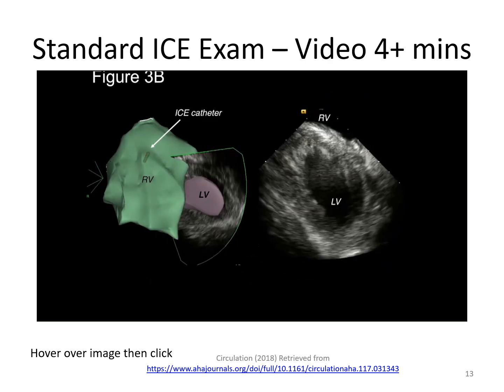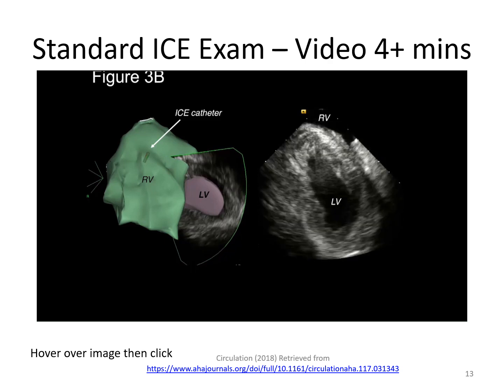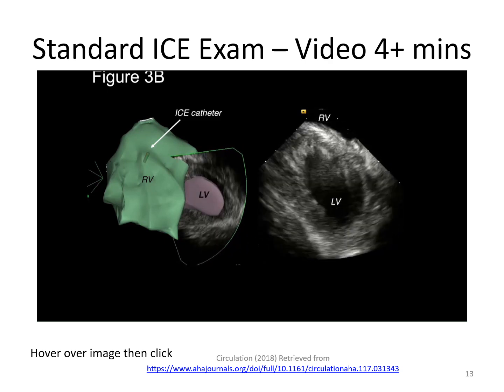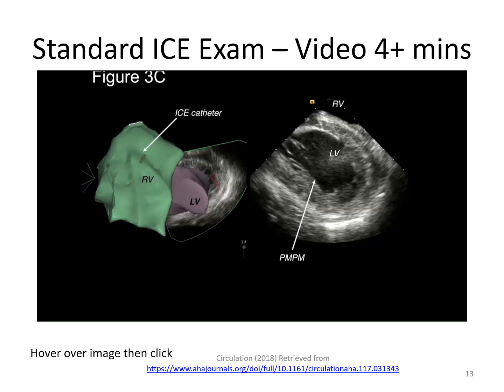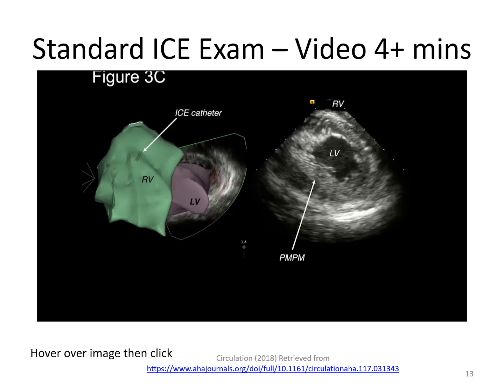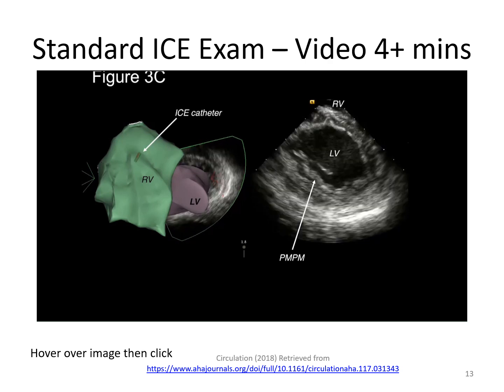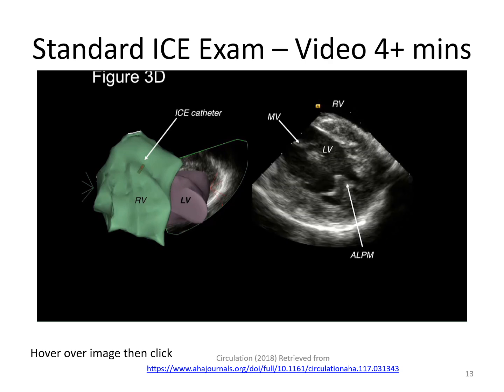From here, progressive clockwise motion will image the left ventricle from apex to base. The first image shows the intraventricular septum and the apex of the left ventricle. Further rotation demonstrates the low septal RV outflow tract, the anteroseptal, and the inferior LV. Here we can examine the posteromedial papillary muscle.